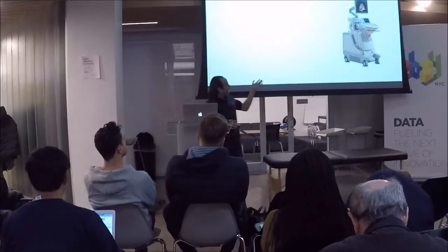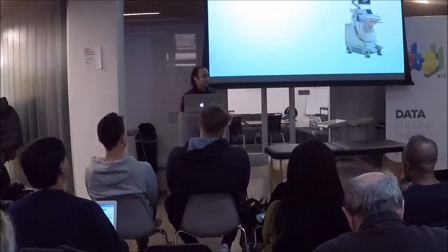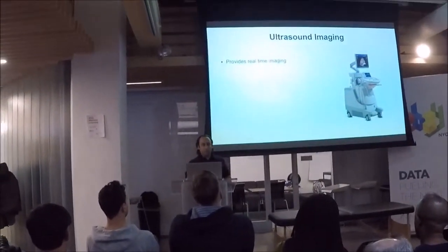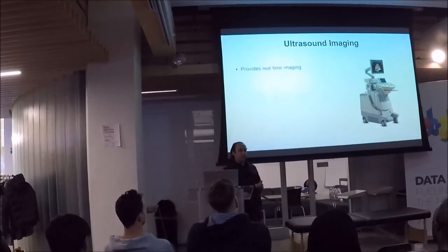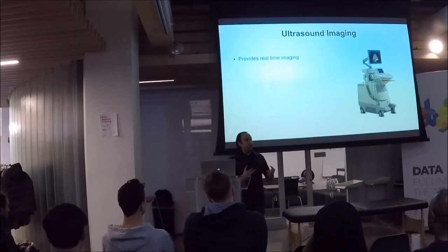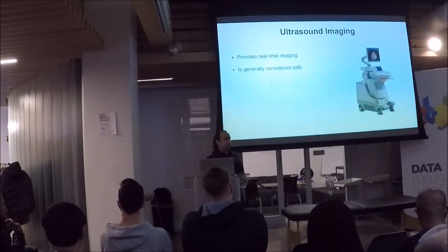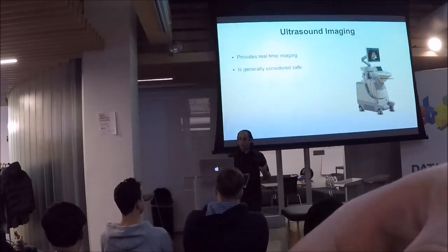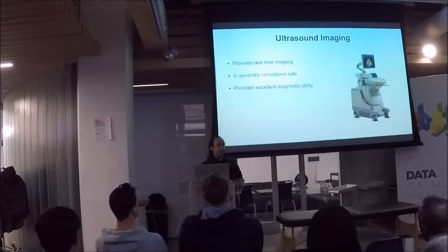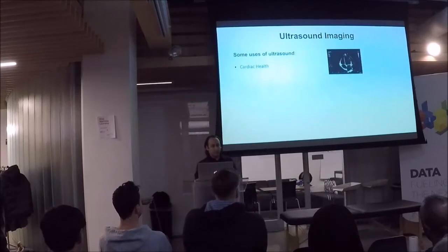Ultrasound imaging. So this is an example of what an ultrasound system looks like. Ultrasound as a modality has a lot of advantages over other medical imaging modalities. The first is it provides real-time imaging. So with an ultrasound system, you can take a probe, put it on someone's body, and get a real-time window into what's going on. It's considered safe. You can ultrasound someone all day long, unlike X-ray or CT. It's an excellent diagnostic utility, so it's used by a large variety of different medical professionals.